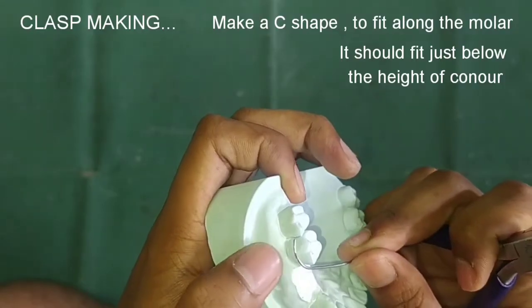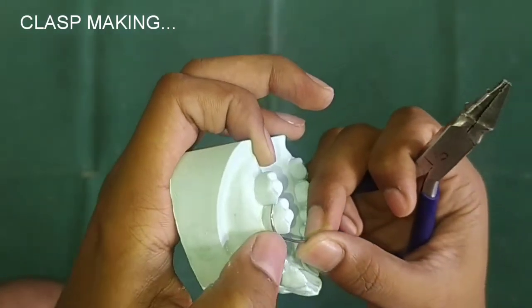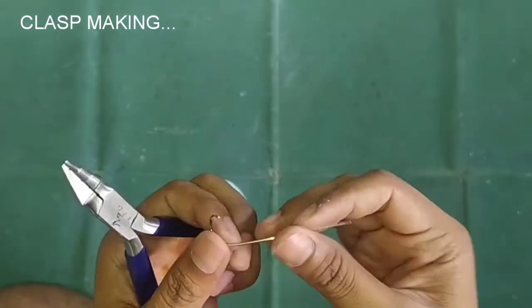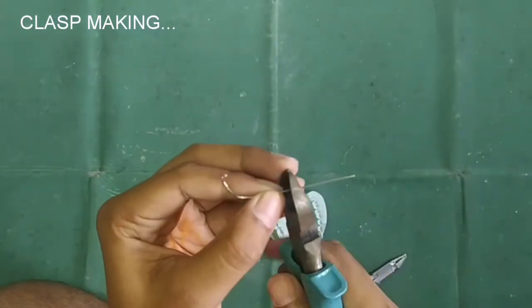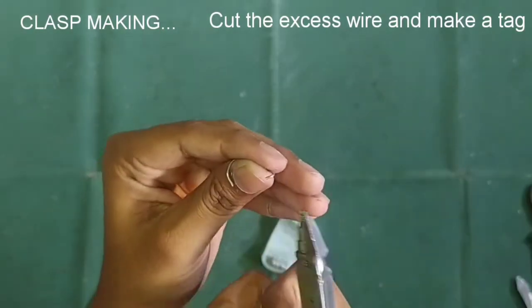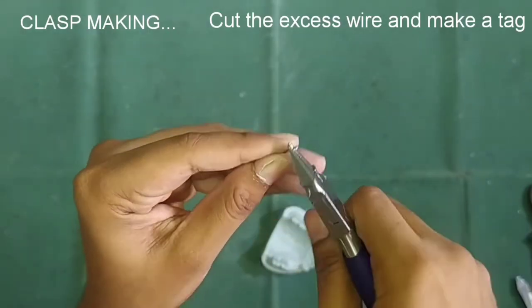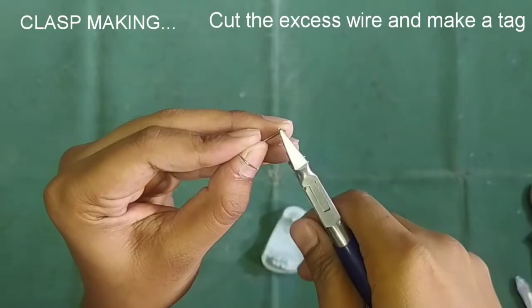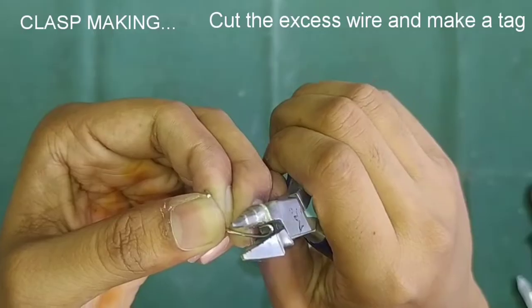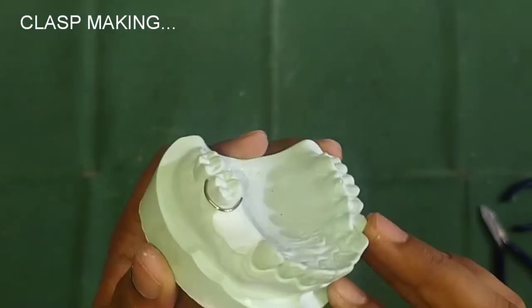Give proper bends to the wire and adapt it to the cast, cut the excess wire, and make the tag arm. Here our clasp is ready.